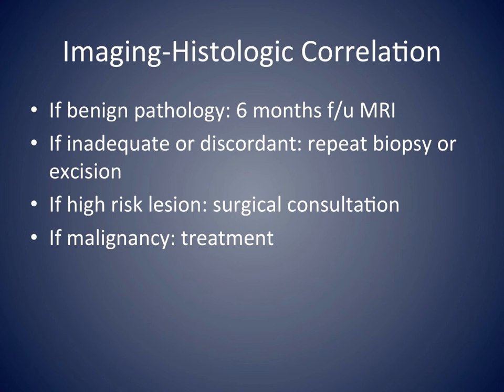Usually, benign pathology results are followed with MRI, typically at 6 months. Inadequate or discordant results require a repeat MR biopsy or an excisional biopsy. High-risk lesions are referred for surgical consultation and malignant lesions for treatment.